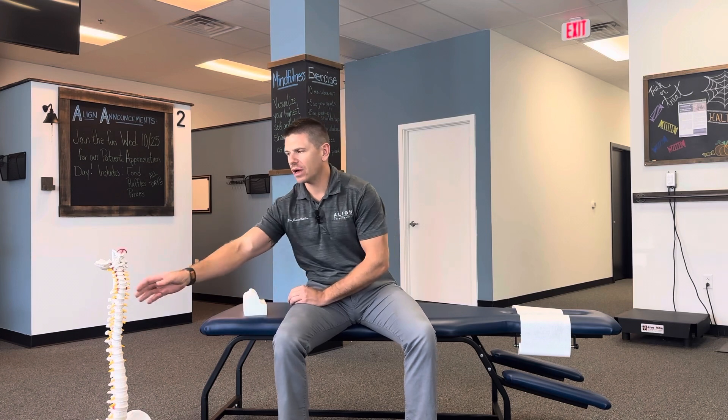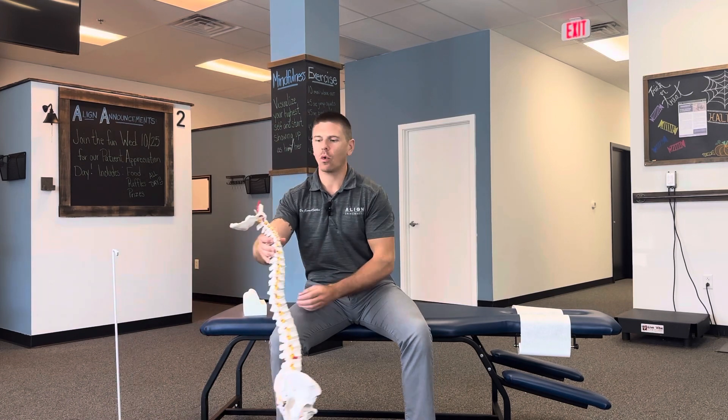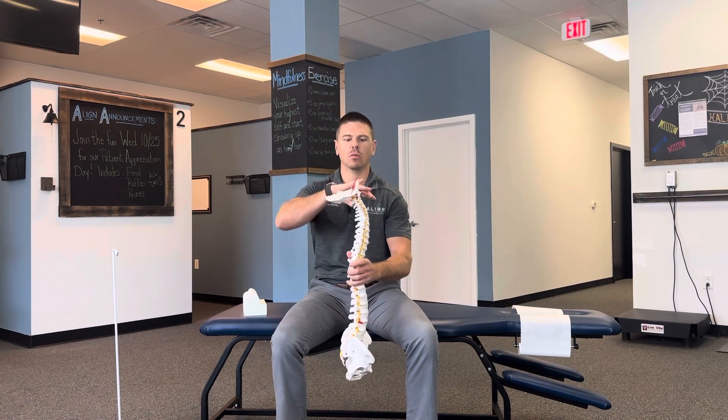In this video, I'm going to be demonstrating how to use the cervical denner roll. This device is a cervical denner roll — it's a hard piece of foam. The reason I would prescribe this is usually if someone's cervical spine is going in the wrong direction or they have a significant loss of the normal curve.